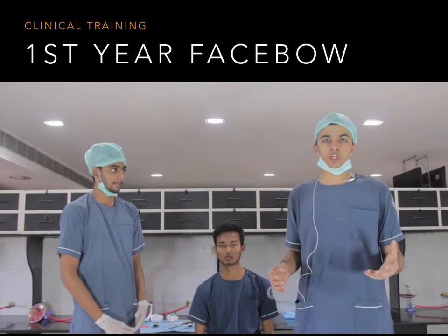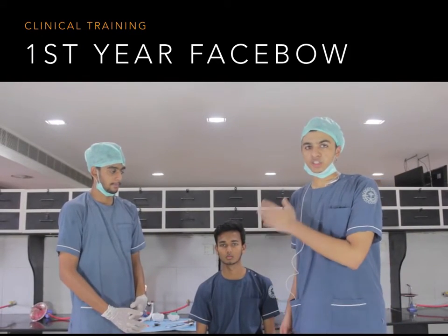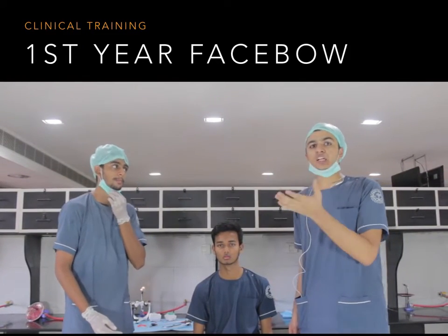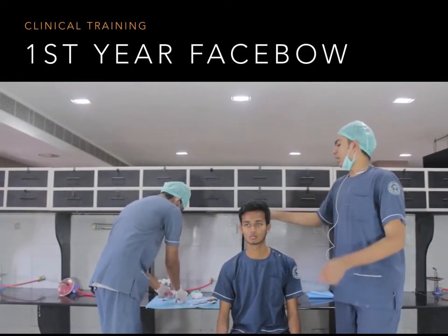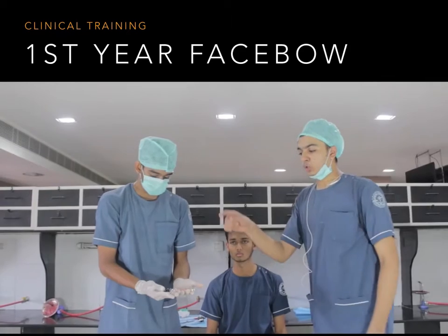Here we are going to demonstrate a typical face bow transfer where an alginate impression of the patient is taken of the maxilla and the mandible, and then a cast is poured. We have a bite fork there, and this is a 3D jig, so we are going to attach the bite fork to the 3D jig.